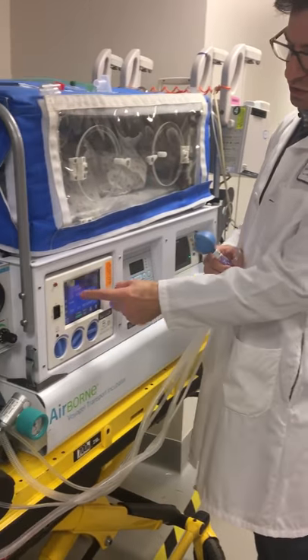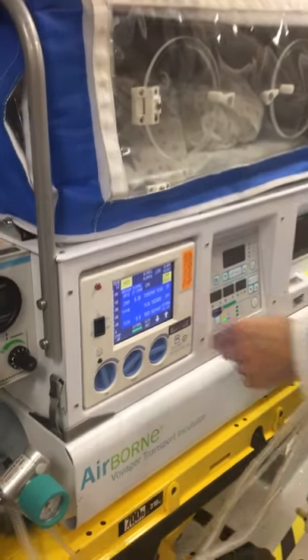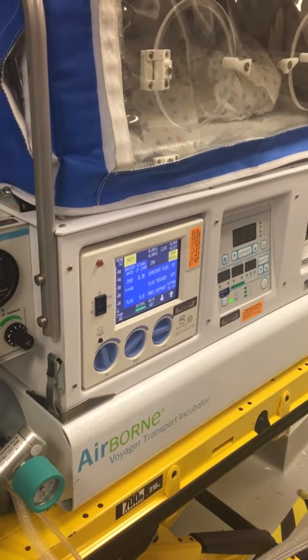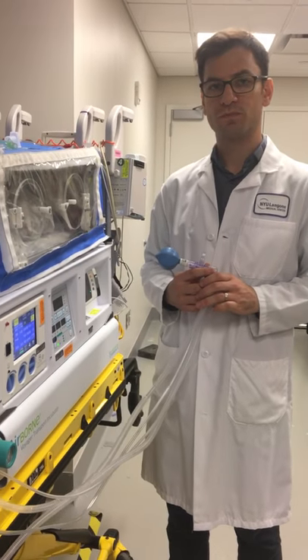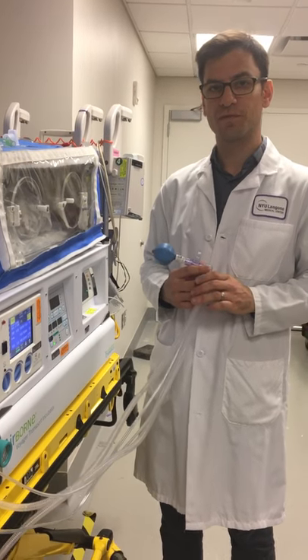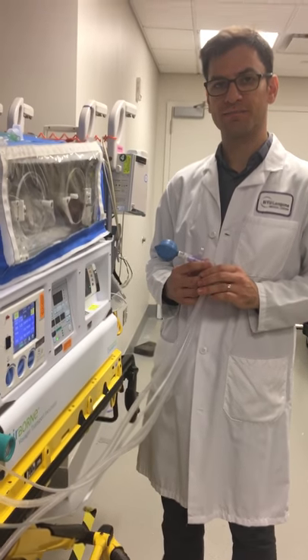That's really the basics of cross vent ventilation. We'll talk more in future videos about how to do nitric oxide with this. Thank you.